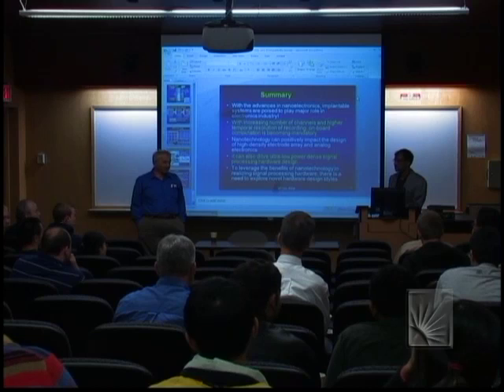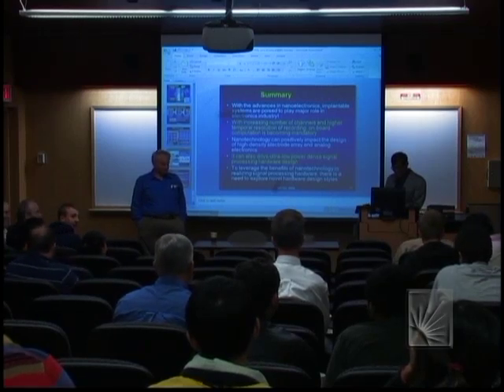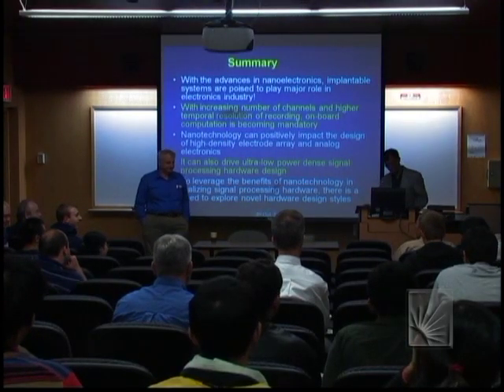That's a lot. These are not rechargeable, right? They're rechargeable. How do you recharge though? That's a challenge too that Darren could talk a lot about. You have to blast away with an RF field and have a pickup coil.